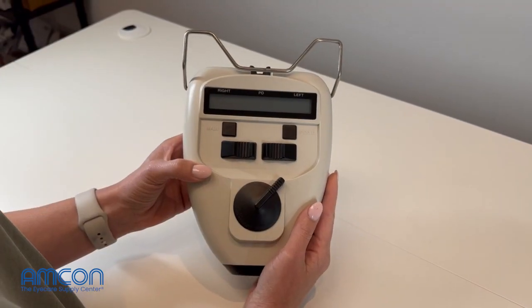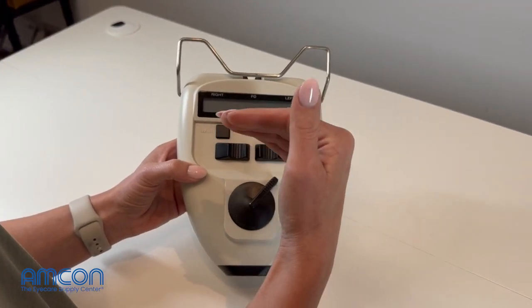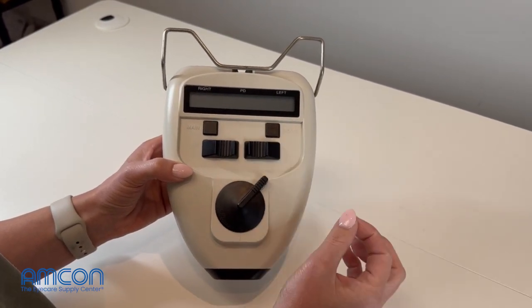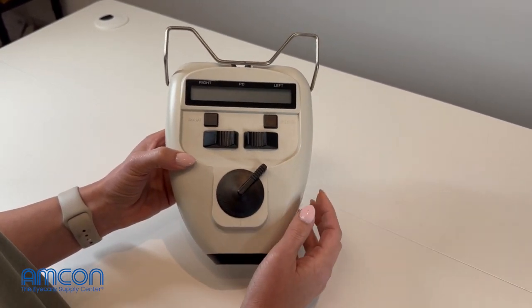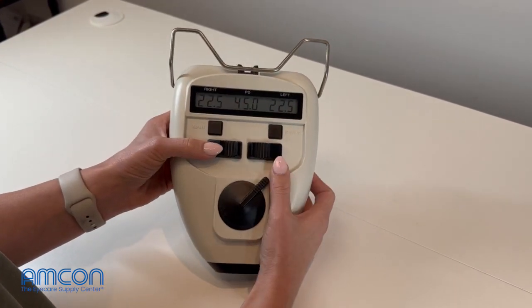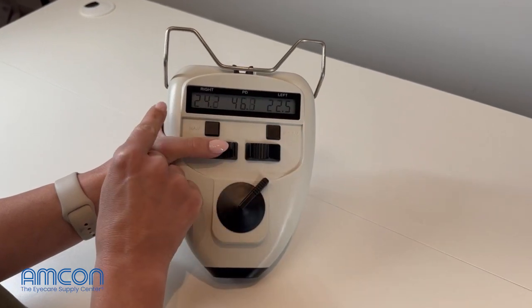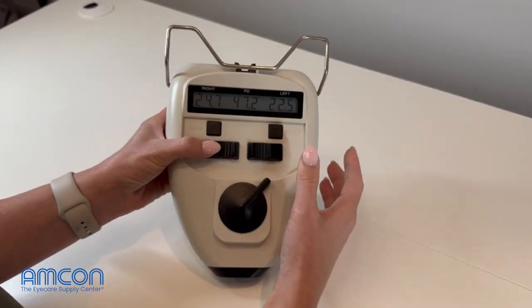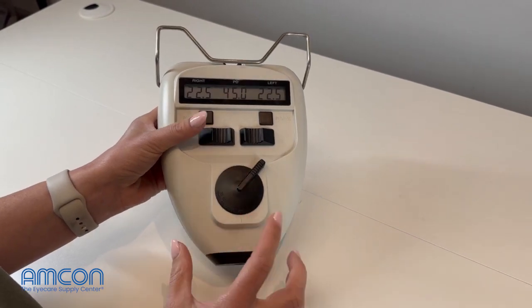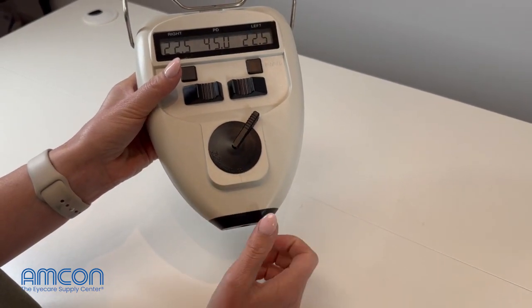If you have your pupilometer in hand and when you turn it on it's reading in 0.1 millimeter increments versus 0.5, that is going to be a very easy fix. Turn your pupilometer on — as you can tell, this one is reading in 0.1. Here in the States, we don't measure PDs that way, so you want to make sure that your little wheel down here is set to your infinity symbol.